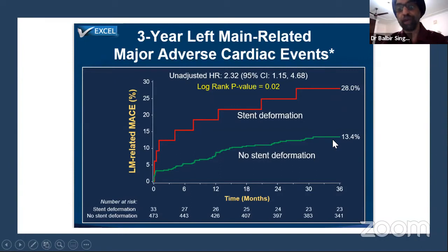Stent deformation is bad. Stent boost helps you to diagnose stent deformation, but not in all cases. So some kind of imaging is very useful. You may not always require another stent to correct deformation, but you require high pressure balloon dilatations. Make sure your lesion is good. Make sure there's no dissection in the proximal part, like we confirmed on OCT after we had corrected that deformation, that there was no proximal dissection, and we didn't need another stent in that case. So this is very important to understand.